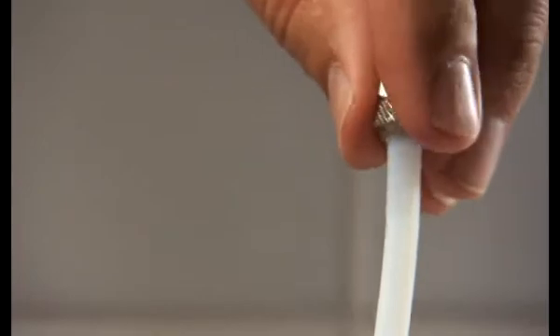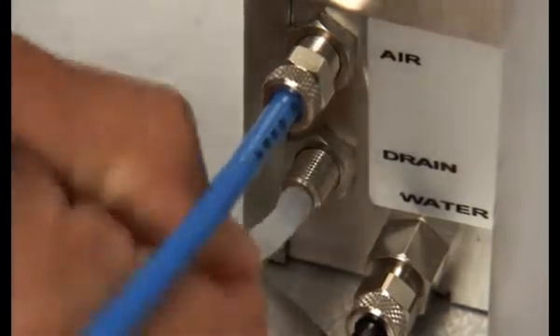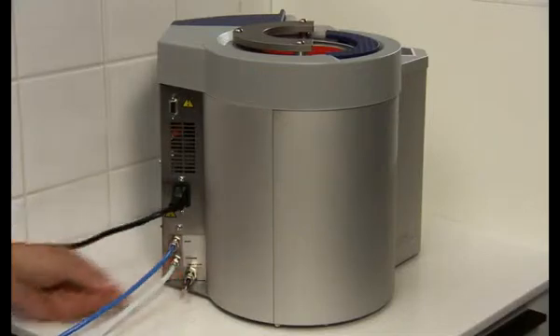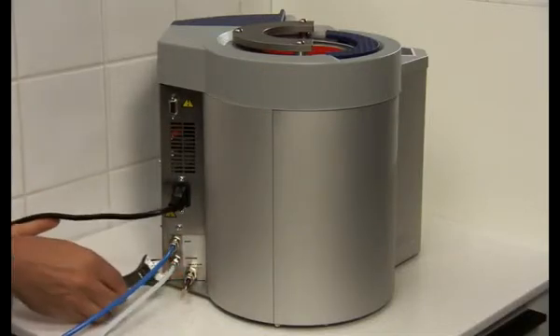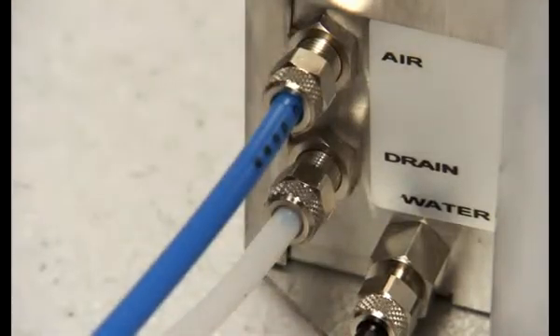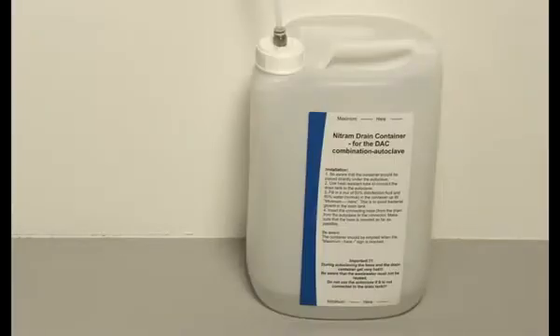The drain tube is mounted in the same way as the compressed air tube onto the drain coupling. Please note that the drain tube needs to be a PTFE tube due to the outgoing hot steam. Maximum length of the drain tube is 3 meters. The drain can either be mounted on a special siphon or on a nitram drain tank with a push-on coupling.